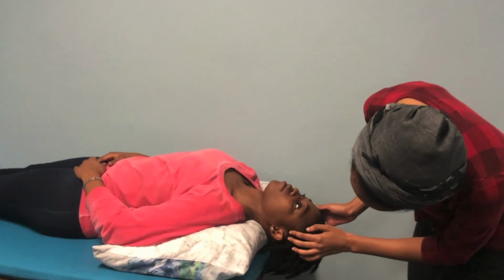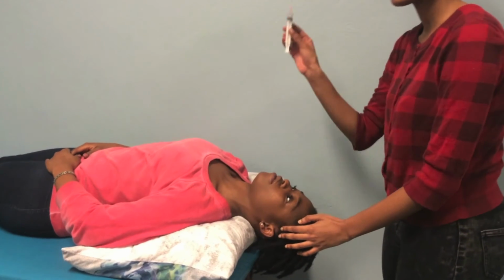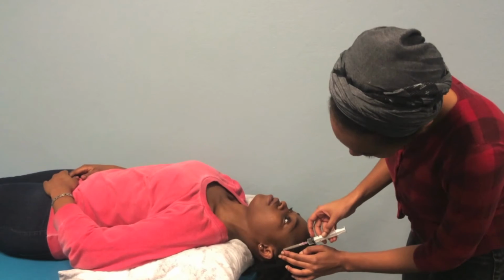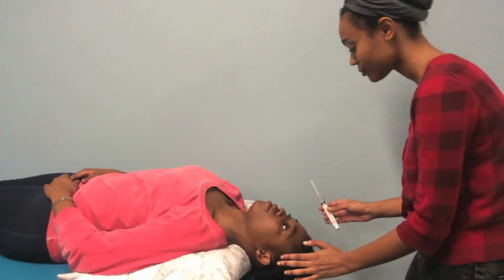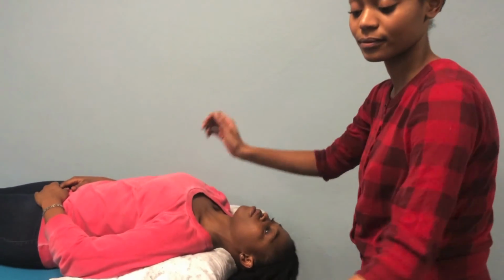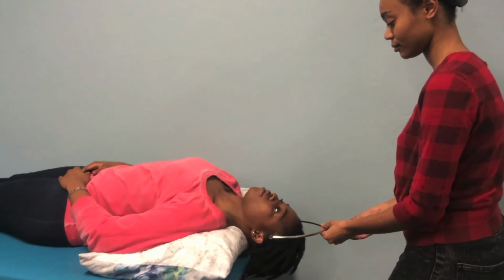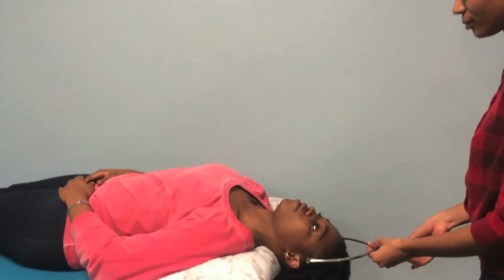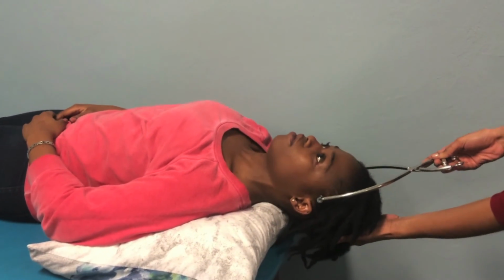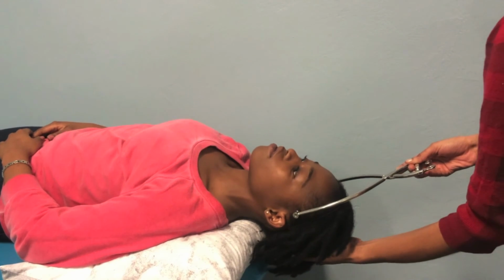Traction tongs are applied 1 centimeter superior to the pinna of the ears after administration of local anesthetic. Before proceeding, palpate locally to prevent perforation of local vascular structures. Start with 5 kilograms in slight flexion, checking the alignment and over-distraction on lateral X-ray. Add 2 kilograms for every cervical level every 15 to 20 minutes.